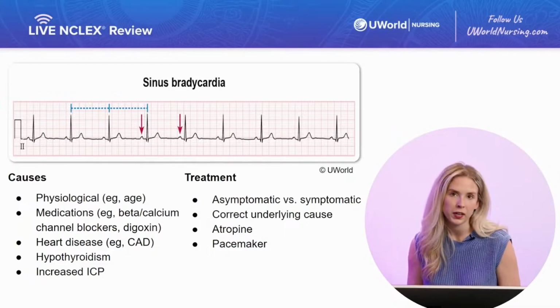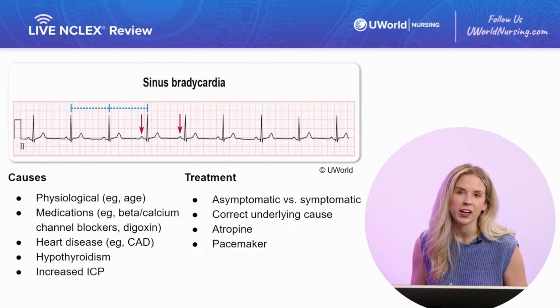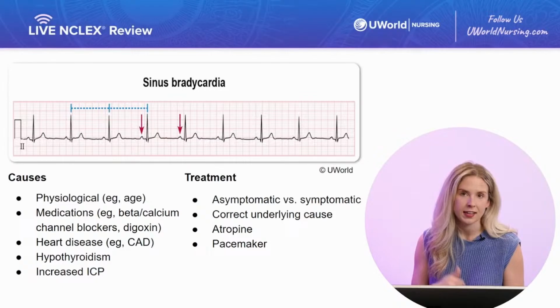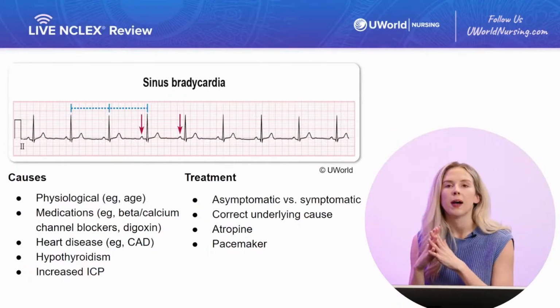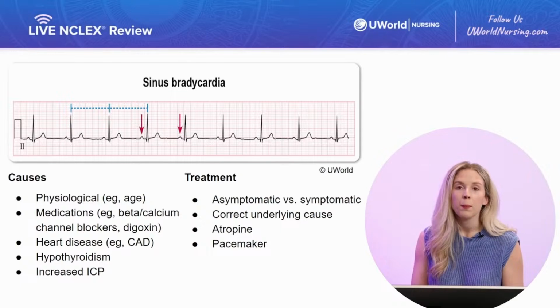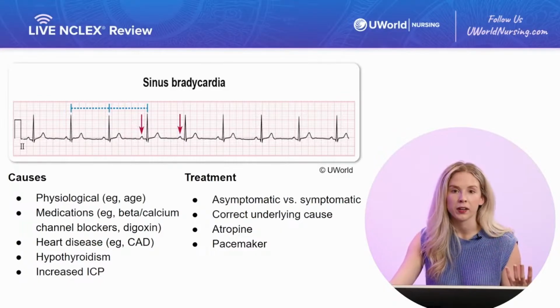So in sinus bradycardia, our SA node, which is what initiates the electrical activity of the heart, is going to be firing slower, or less than those 60 beats per minute. We can tell this by counting those R's. So again, 10-second strip, we have 9 R's. So we multiply that 9 by 6 to represent 60 seconds or 1 minute, which gives us a heart rate of 54 beats per minute. Again, our normal range is 60 to 100. 54 is below that, so we know it's bradycardia.